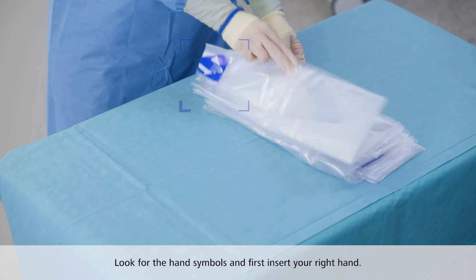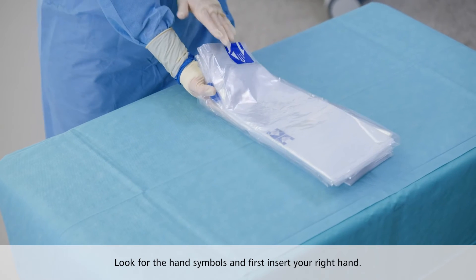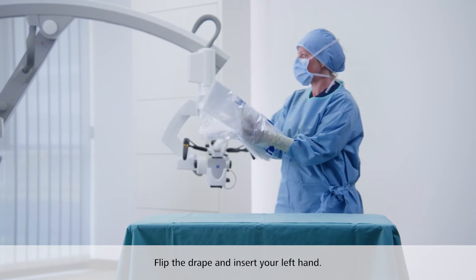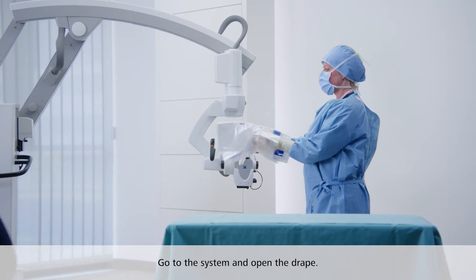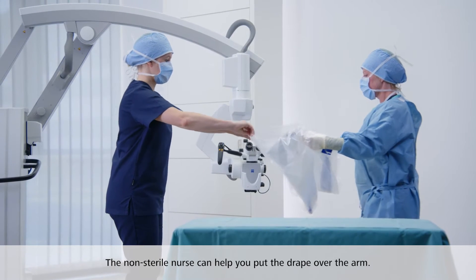Now look for the hand symbols and first insert your right hand at the symbol. Flip the drape and insert your left hand on the other side. Now go to the system and open up your arms to open the drape. The non-sterile nurse can help you put the end of the drape over your arm.